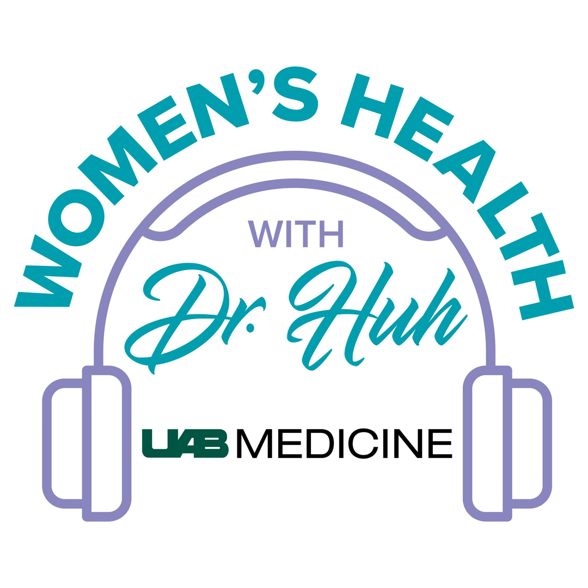Now, the robot does do some valuable things for the surgeon. If there's any fine tremor in your hand, it actually eliminates that. It also works with wristed instruments that allow you to do things that you can't do with a straight laparoscopic instrument. But it is still laparoscopic surgery. It is still managed by the surgeon, but it is a great tool to enhance either the things that the surgeon can do for you as a patient or the number of patients that can benefit from laparoscopic surgery.